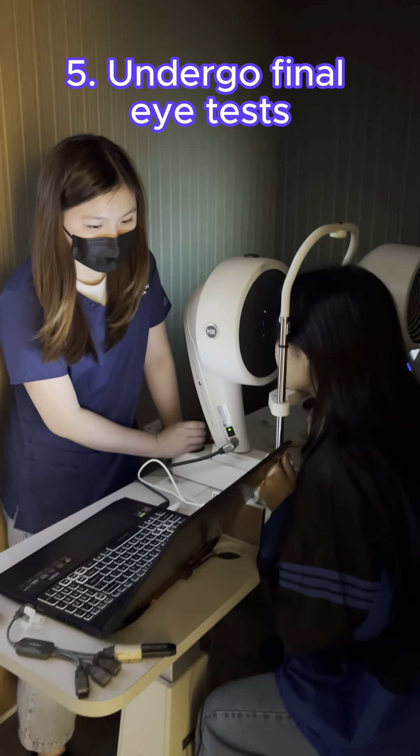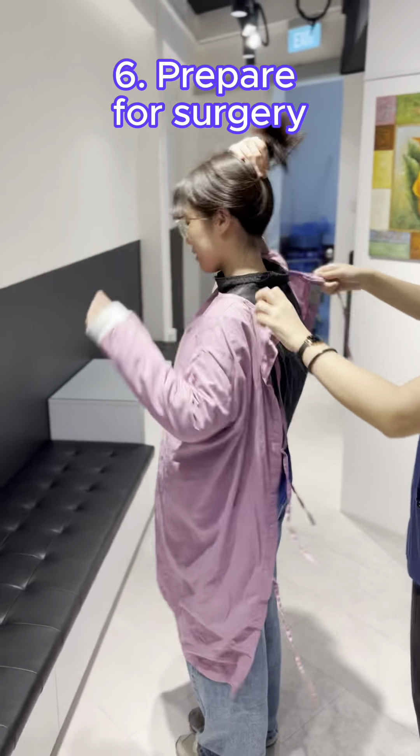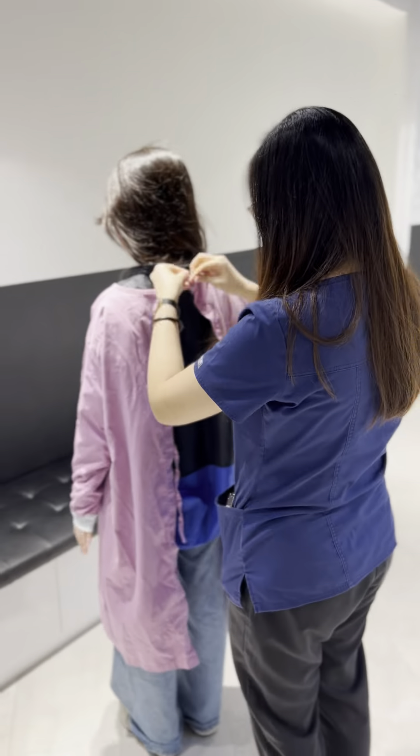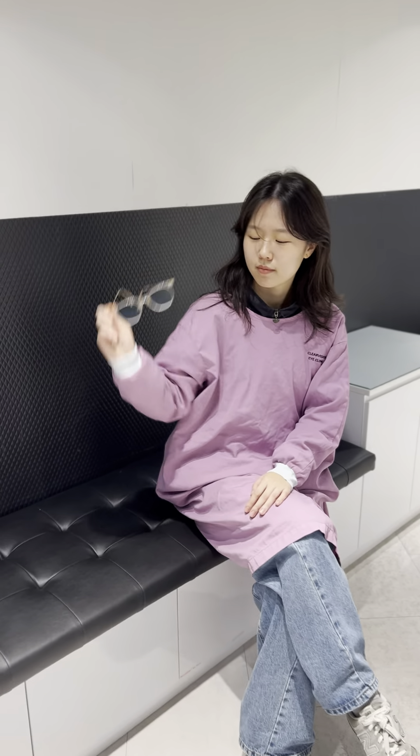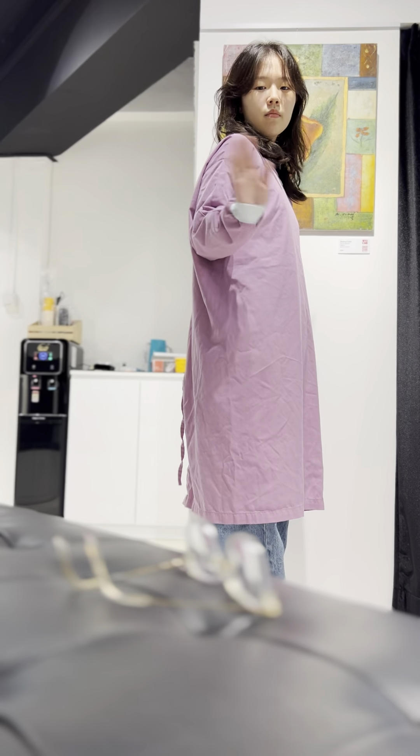Go through the final round of eye tests. Get prepared for surgery. Our clinic assistants will help you put on your PPE to ensure a clean and safe surgery. And this is when you will say goodbye to your glasses forever.